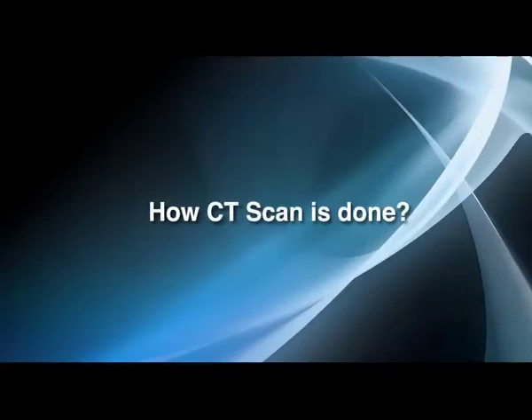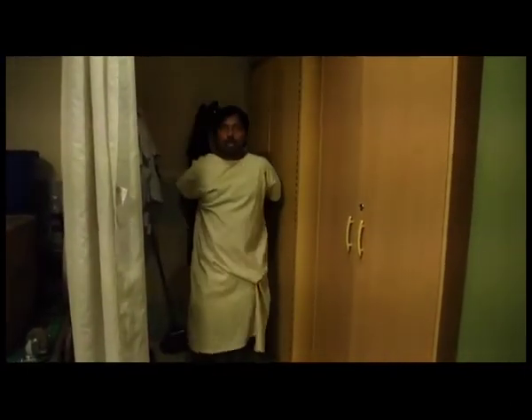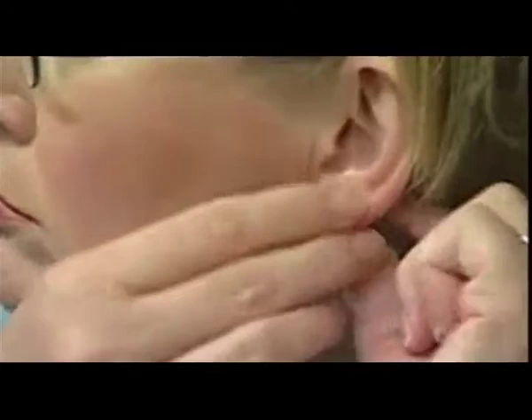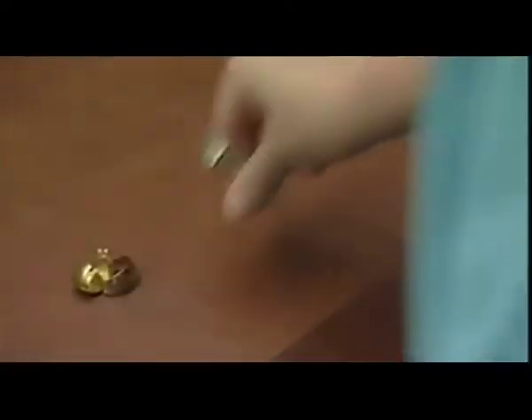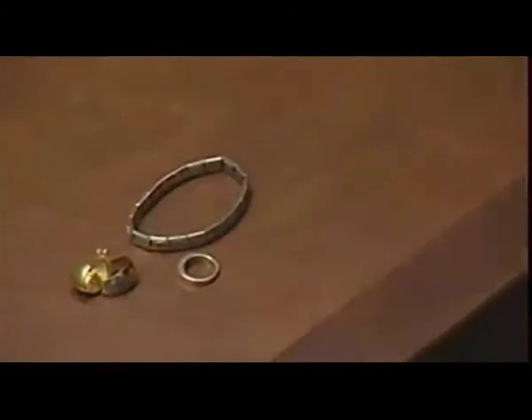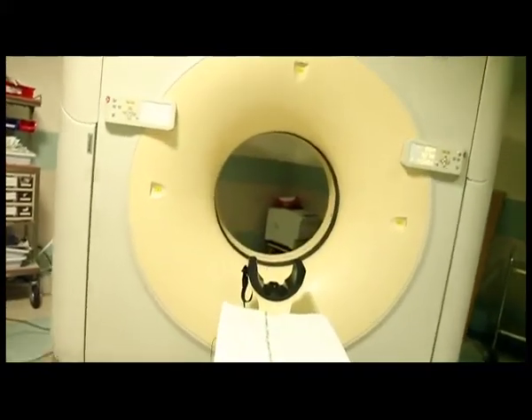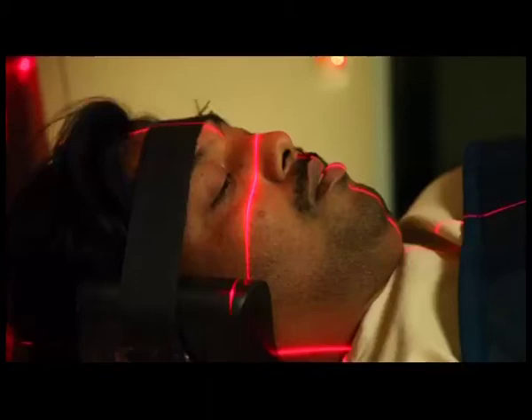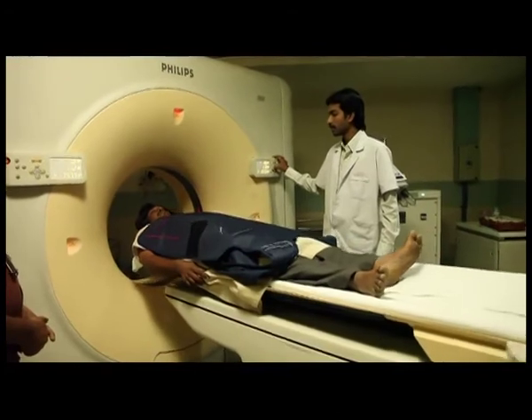How is CT done? Depending on which part is going to be scanned, a patient has to prepare by changing into the hospital gown and removing metal jewelry, which might interfere with image results. CT scanners are large ring-like structures. You lie down on a table that slides into the hole, which is called the gantry. Strapping and pillows help you stay in position. During the CT scan of the head, the table may be fitted with a special cradle that holds your head still.